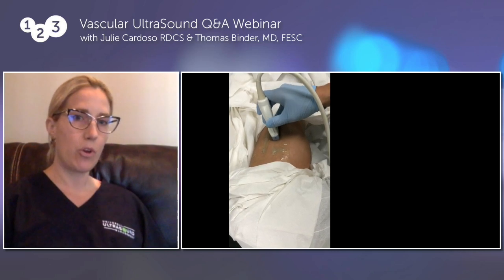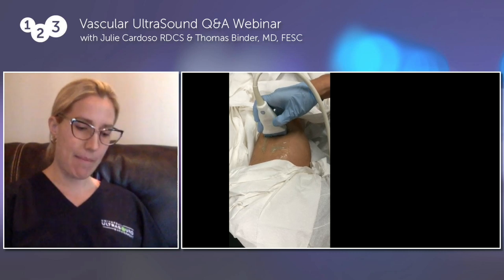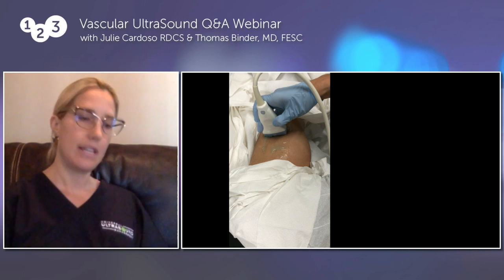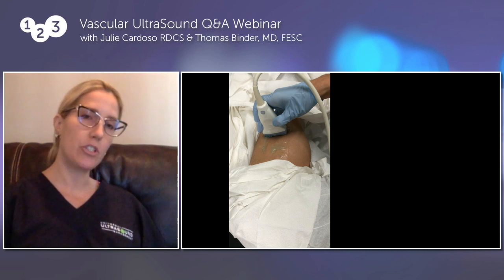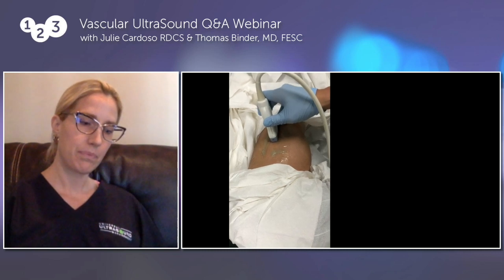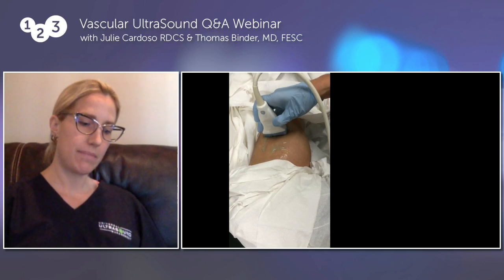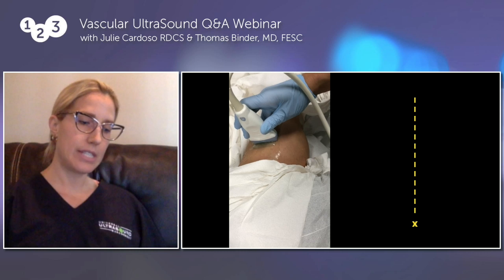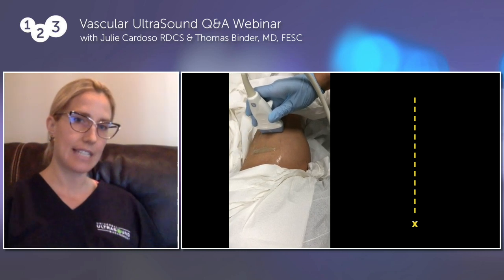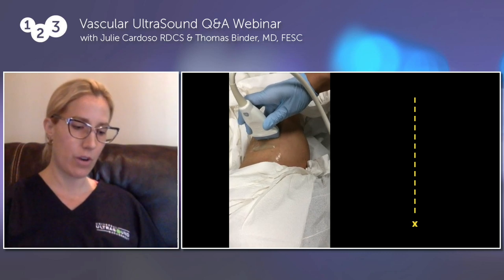So this is the probe maneuver of rotation. I'm actually changing how I'm lining up the transducer to the leg. So I'm going to rotate from the longitudinal view to the transverse view. And now you can see that I've rotated the probe. I am sliding along the X axis. So the image would be displayed on my screen in the short axis view.